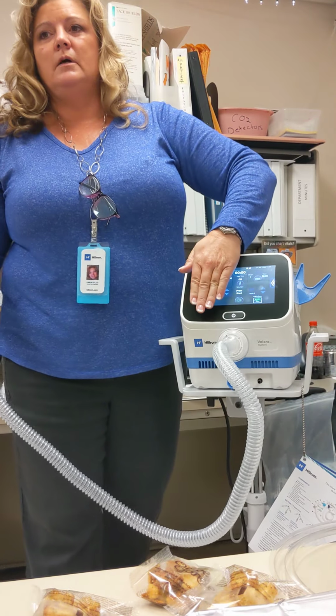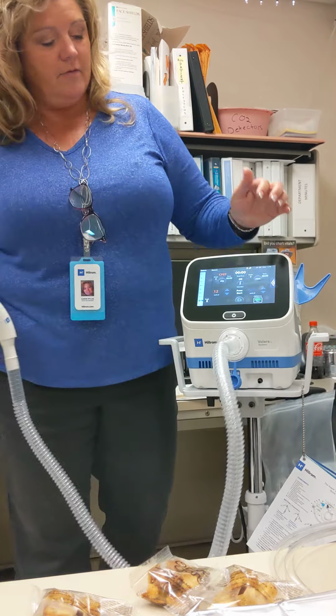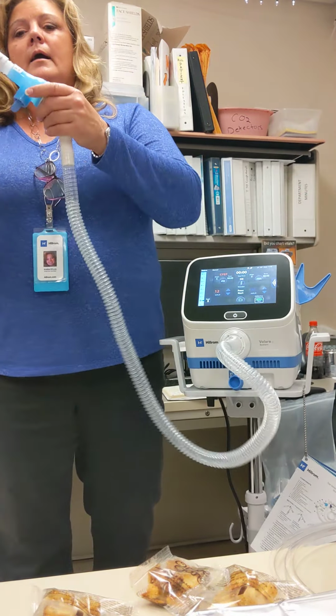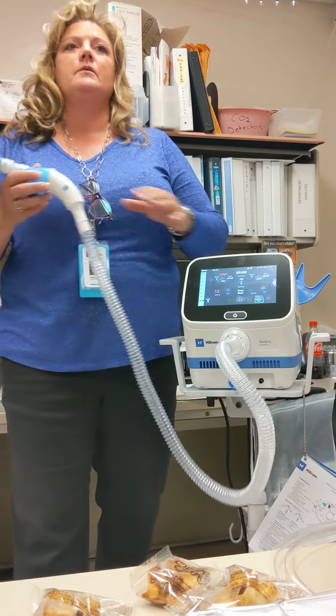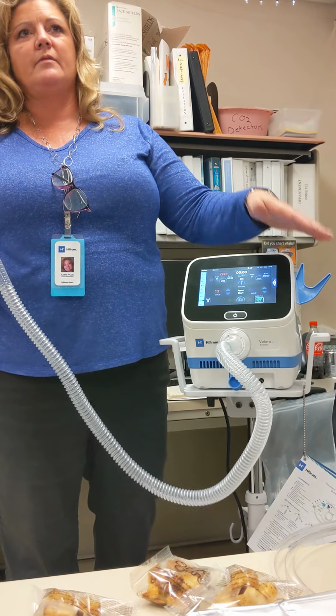You're not going to do lung expansion. You're just going to do oscillation. Now this is where it's a blower. When we have the blower on a vent patient, we're diluting because it's a blower. There's no FiO2, right? So you increase your FiO2 on your patient on the vent.